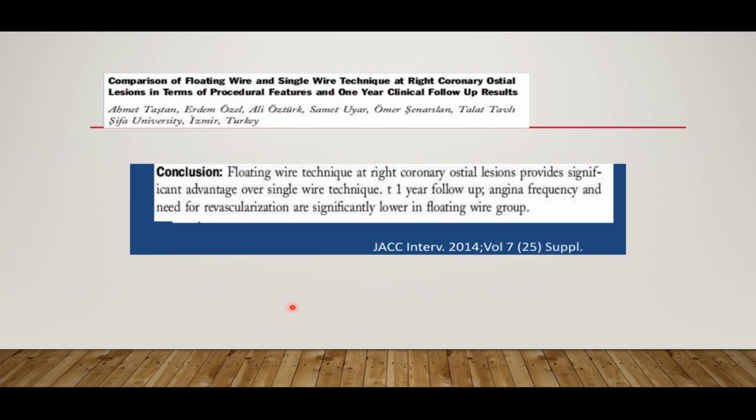So, what is the floating wire technique? Did it really succeed in making a difference? Yes. Floating wire technique compared to single wire technique was better in angina frequency and need for revascularization after 1 year of follow-up.